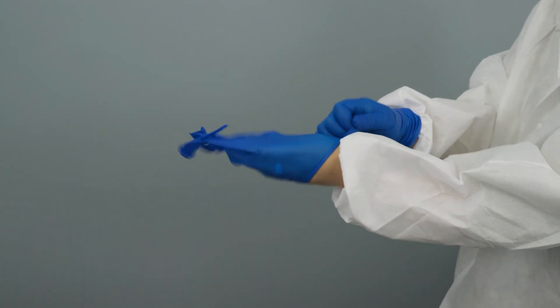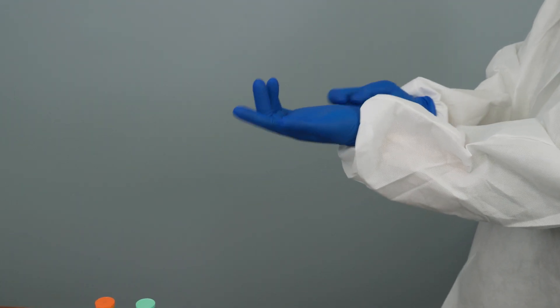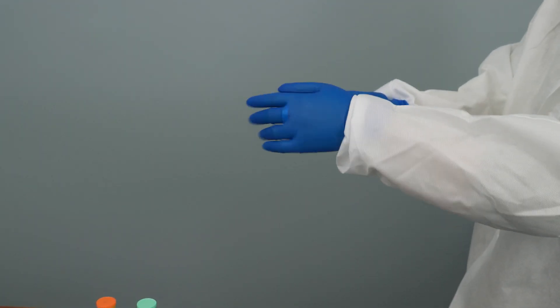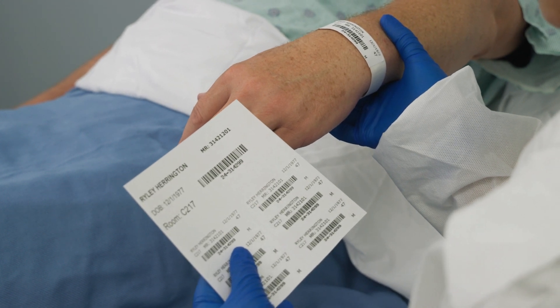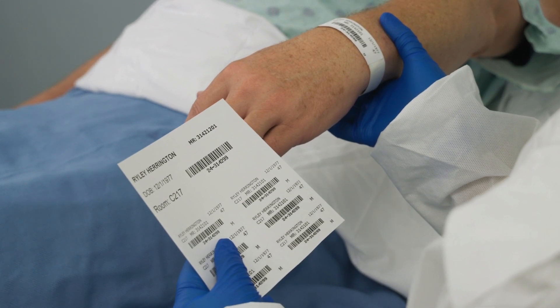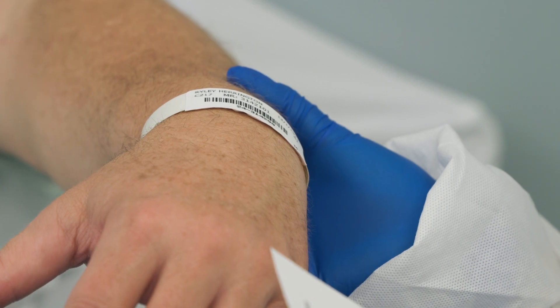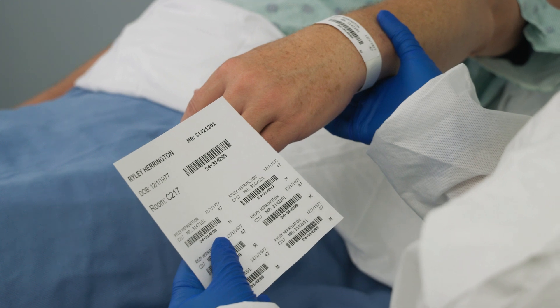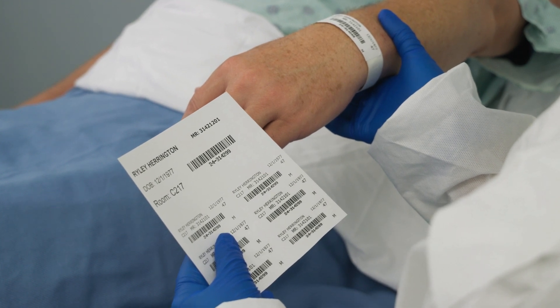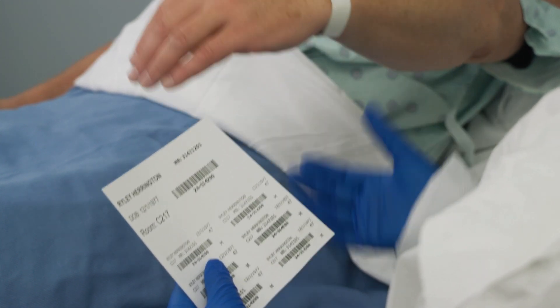Wash your hands with soap and water and then dry them, or apply an alcohol hand rub. Then apply well-fitting non-sterile examination gloves before starting the collection procedure. Confirm the patient's identity and check that the requested laboratory test and patient information matches the patient's identity, either using a printed label form or mobile device.